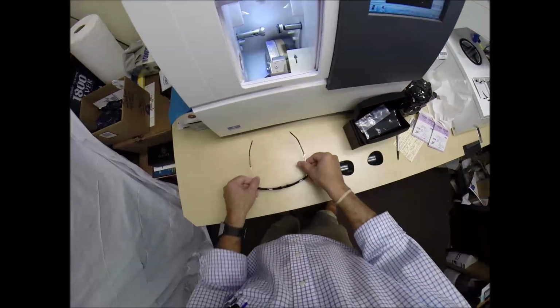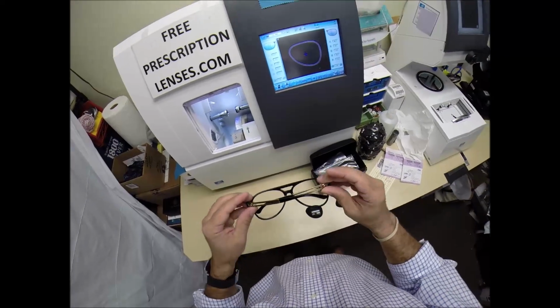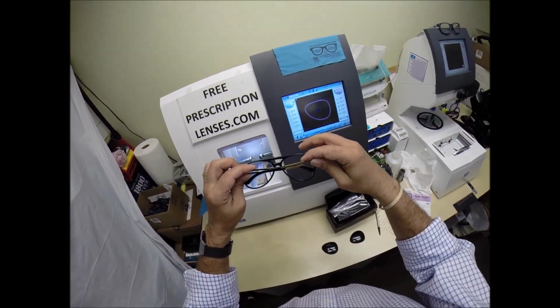Let me put mine back on so I can see what I'm doing, yo. Flip that over, press down, there is no wobble. Close each temple to make sure they overlap perfectly. And they do, that neither one is askew or crooked like that.